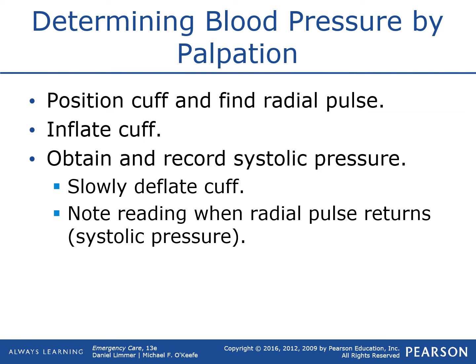Again, the pressure in the cuff is going to a level that your heart can push past it, and you're going to feel that pulse again. So that will tell you your systolic pressure only. Systolic is better than knowing nothing, but we really want to know our systolic and diastolic because the diastolic does tell us some more diagnostic information.